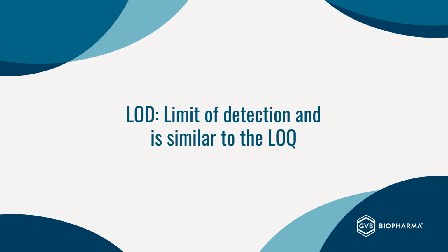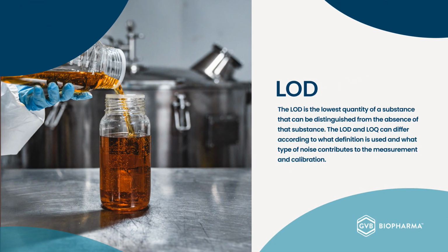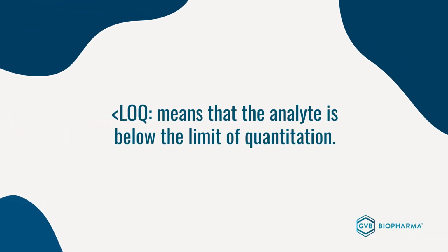LOD stands for the limit of detection and is similar to the LOQ, but they aren't always the same. The LOD is the lowest quantity of a substance that can be distinguished from the absence of that substance. The LOD and LOQ can differ according to what definition is used and what type of noise contributes to the measurement and calibration. Less than LOQ means that the analyte is below the limit of quantitation.